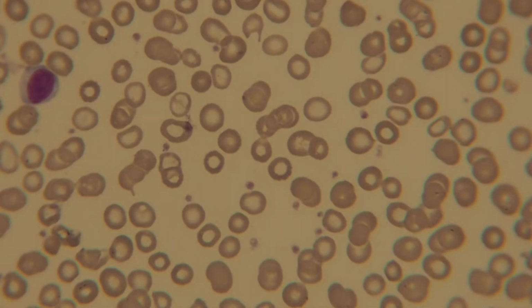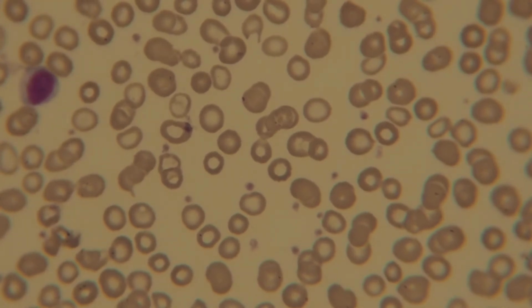My instrument is telling me that the MCV is 80, which is a little bit less severe than it actually shows when you're looking at the microscopy. And it's also telling me that my RDW is 26. Okay, there is a level of anisocytosis, but 26, it's being exaggerated because of the rouleau.